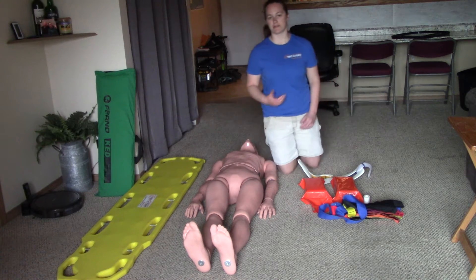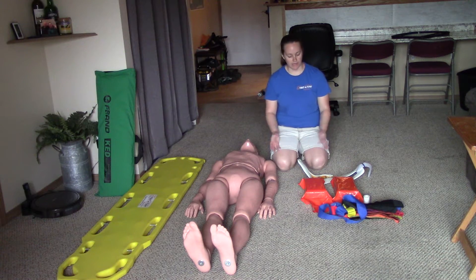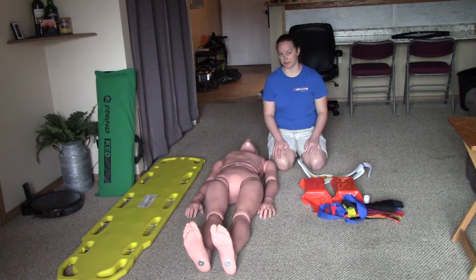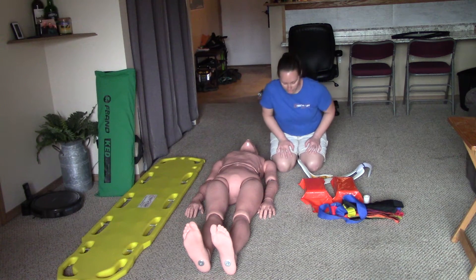This is a demonstration on how you'll be expected to backboard a patient for the backboarding station for the skills test. I'll probably throw in some extra things just out of habit. I'll flag those for bonus points so you'll know they're not required, but it's nice if you throw those extra verbalized steps in.